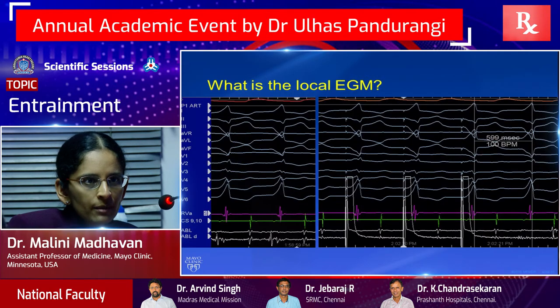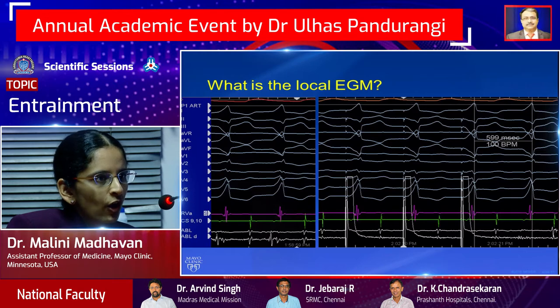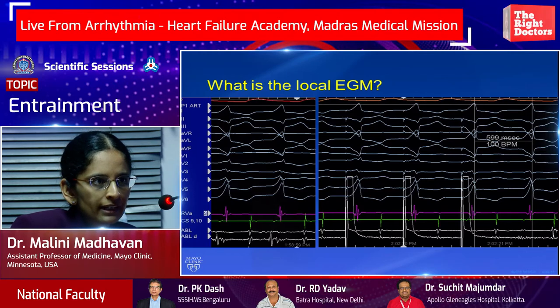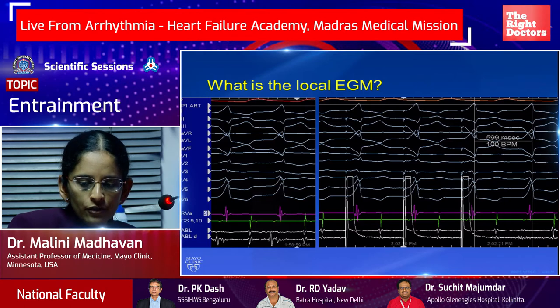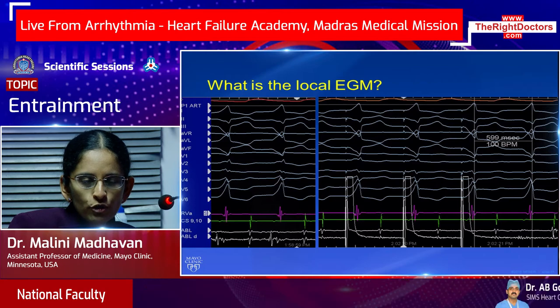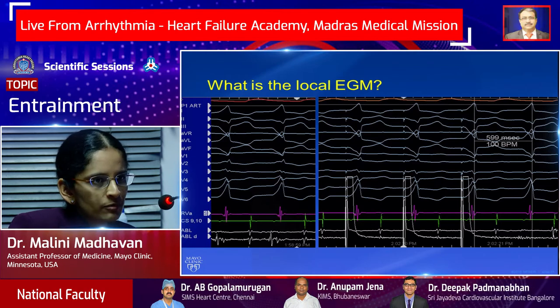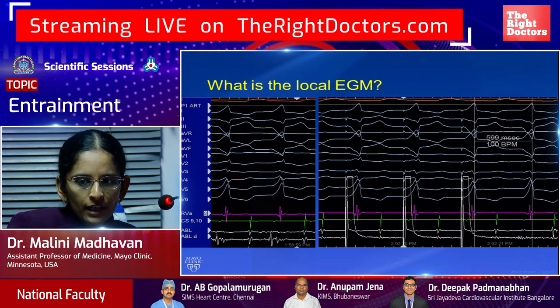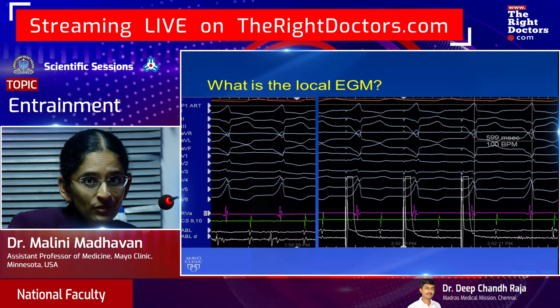Another thing that comes up in VT is, you may have a lot of different multi-component electrograms on your catheter during mapping and entrainment mapping as well. And it's very hard to know which one of those multi-component electrograms is the local electrogram, right? So overdrive pacing from those sites can be helpful. And it's also important to recognize that, so you measure the right electrogram for your PPI.